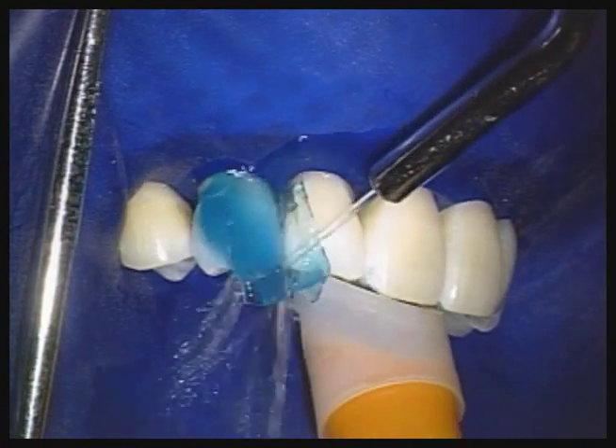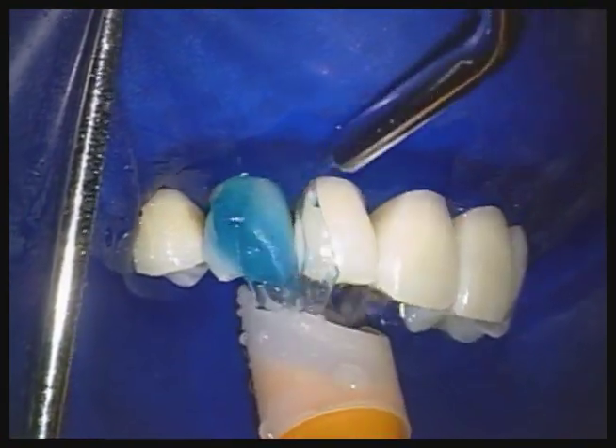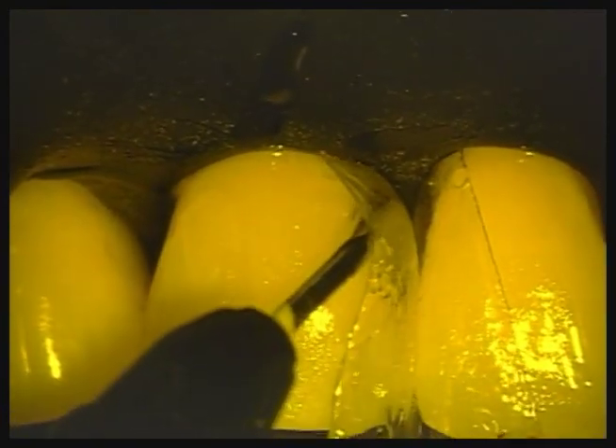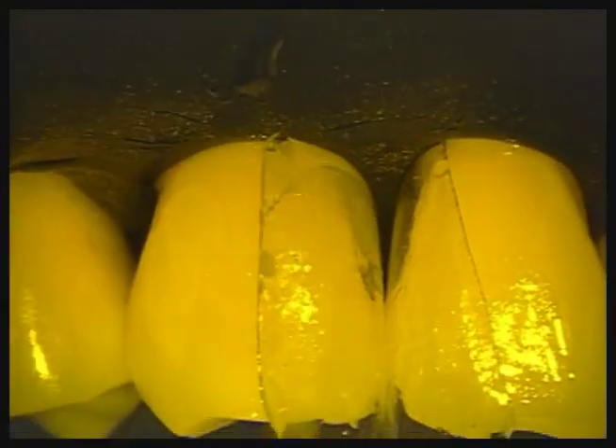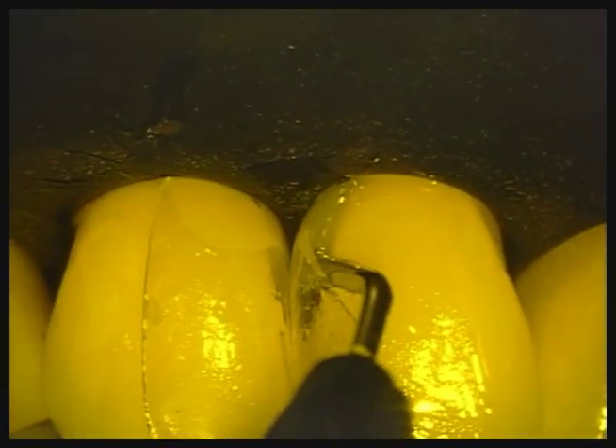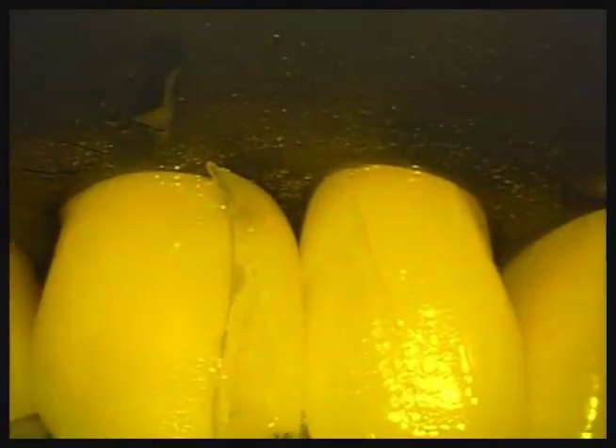Other than the use of the mild spray abrasive, no cutting of the tooth is necessary. Make sure to inject the flowable composite directly into the small pool of bonding resin at the gingival margin to avoid trapping an air bubble. I recommend injecting from both the facial and the palatal. When bonding to etched enamel with the injection molding technique, there is no need to cure the bonding resin before placing the composite.